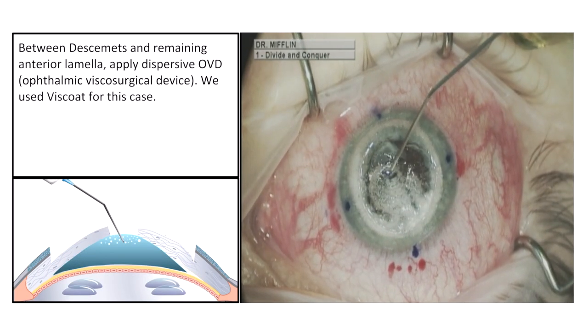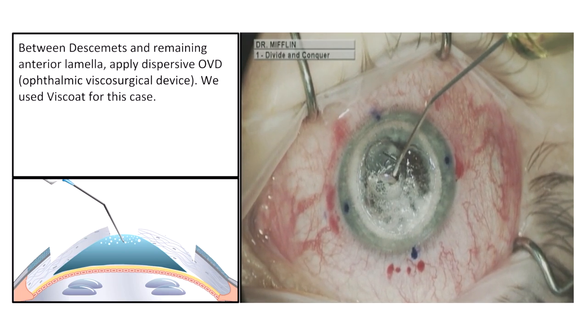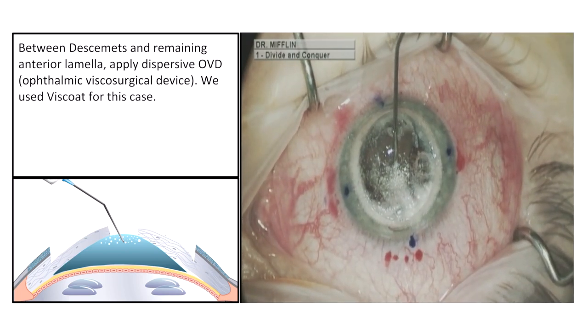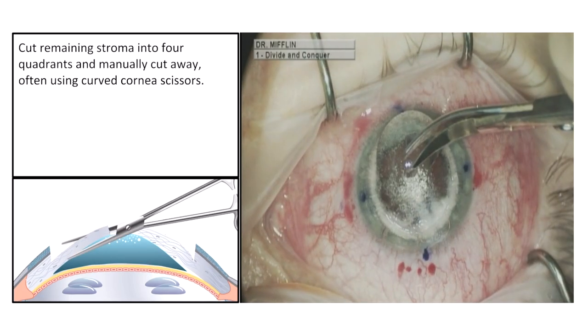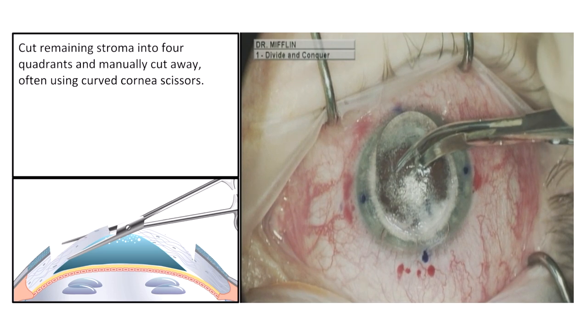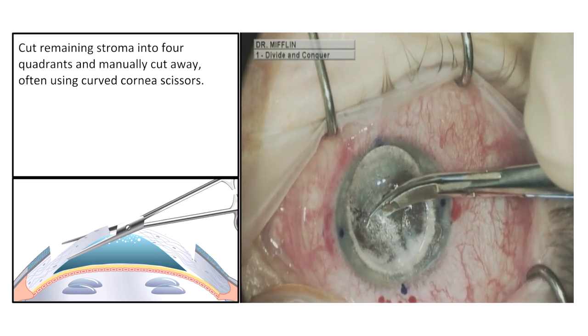Between Descemet's and the remaining anterior lamella, apply dispersive OVD, or ophthalmic viscosurgical device — Viscoat was used for this case. Cut the remaining stroma into four quadrants and manually cut away, often using curved cornea scissors.